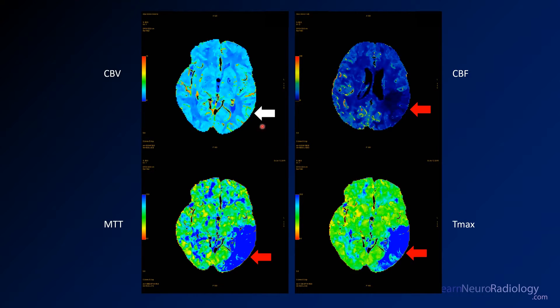Here you see the perfusion images. The cerebral blood volume is relatively maintained — it looks pretty normal — but you start to see areas of decreased blood flow, with a wedge-like region visible. On MTT you see a significant increase in mean transit time as well as T max. So what you're looking at here is predominantly an area of penumbra, although the flow is showing some early signs of decrease.